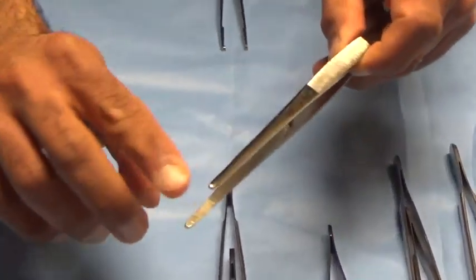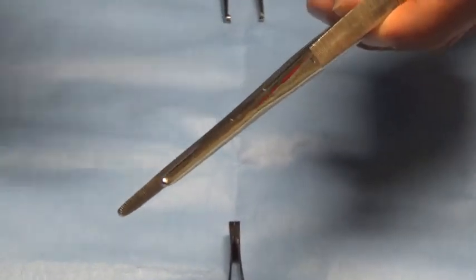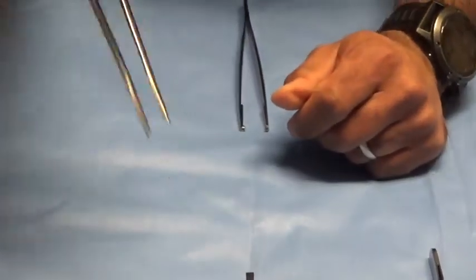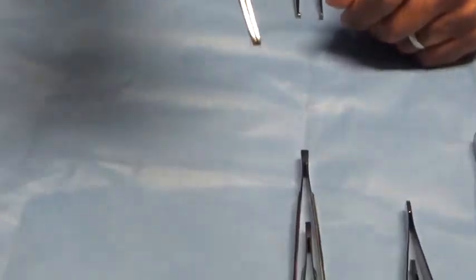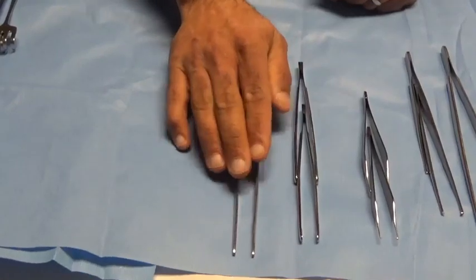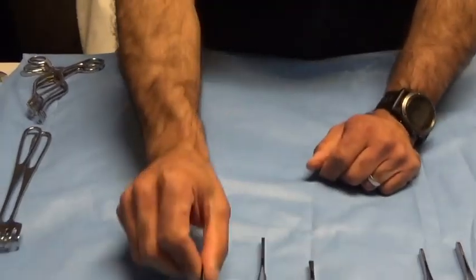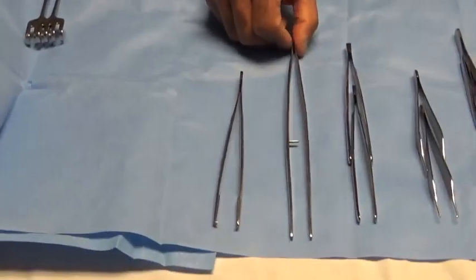The next forceps — notice the difference contrasted with a DeBakey: these ridges are not designed for picking up tissue but rather these are packing forceps, designed to pick up packing material. Packing forceps are designed for picking up Kerlix or packing gauze. If you're packing into deep cavities, these afford you the opportunity to grip the gauze and push it down deeply to effect packing in deeper spaces. Important distinction: not designed for tissue handling, designed to handle packing material.